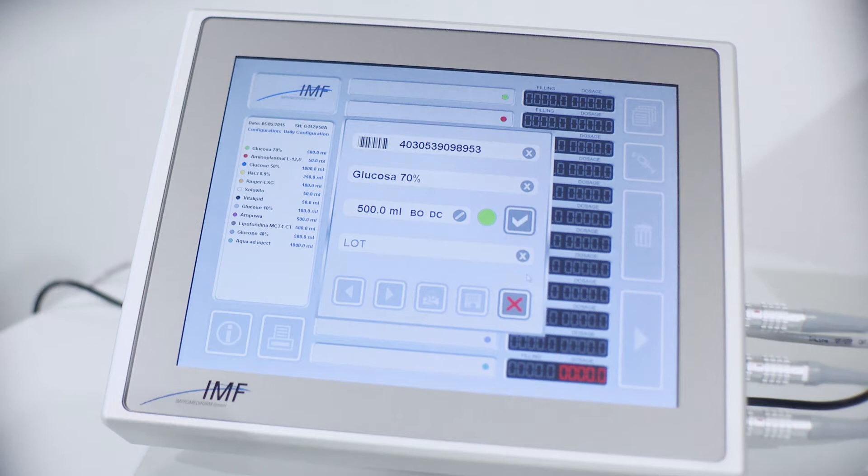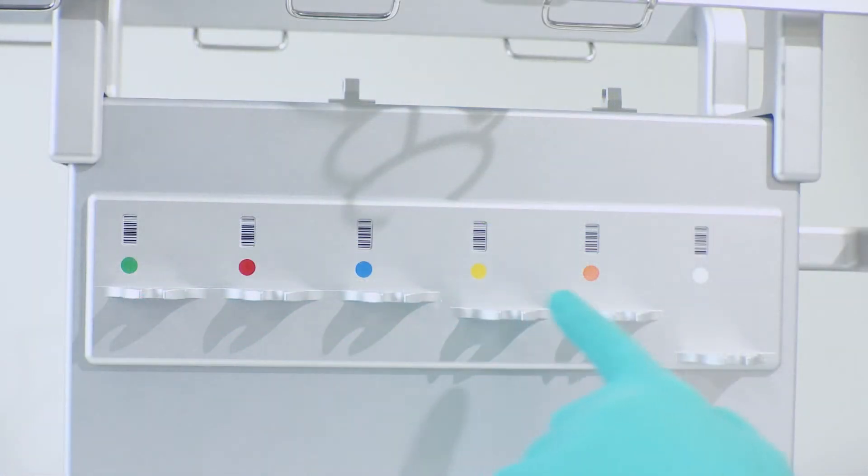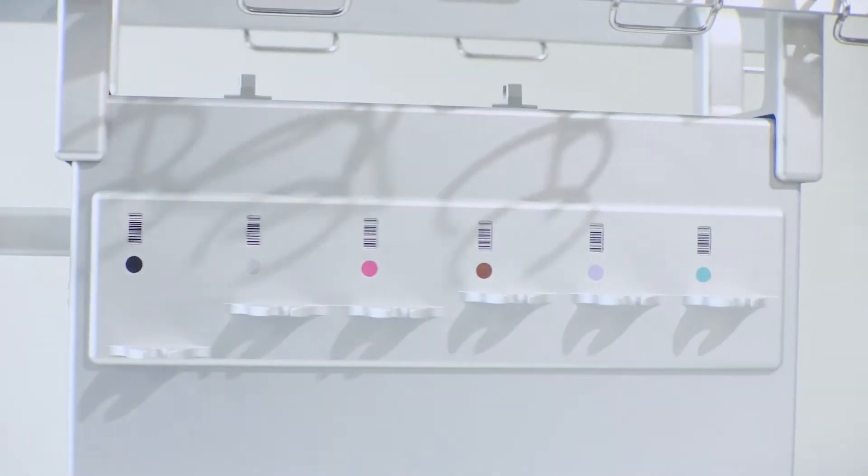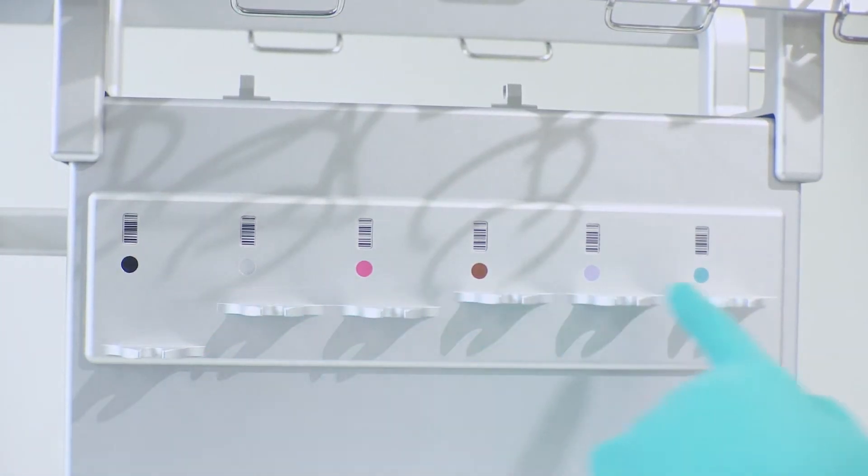Once the configuration is selected the compounder will give all the appropriate information like ingredient name, container size, kind of container and which connector to use. There's also the possibility to type in the lot number. The Medimix compounder will guide the operator to set up the equipment following the color-coded lines, green to white and black to turquoise.